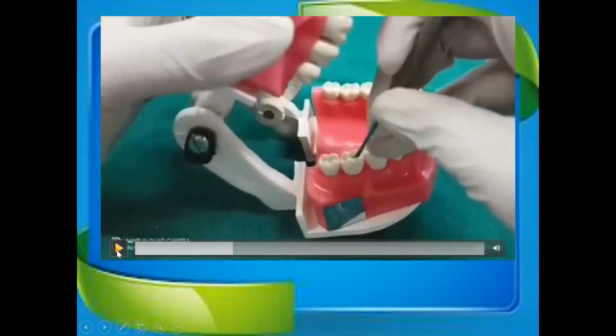I hope you all can appreciate that this is conventional finger rest, in which the fourth finger is resting on the tooth surface just immediately adjacent to the working area.